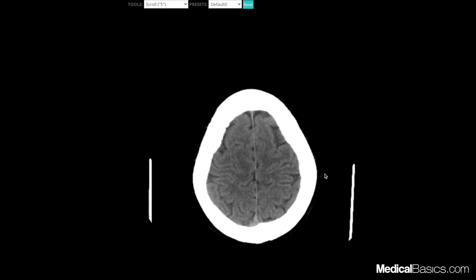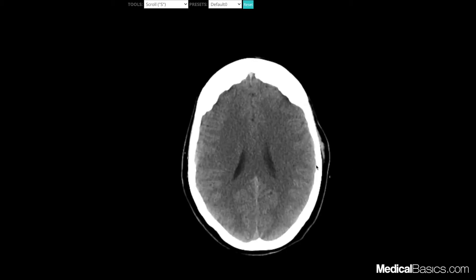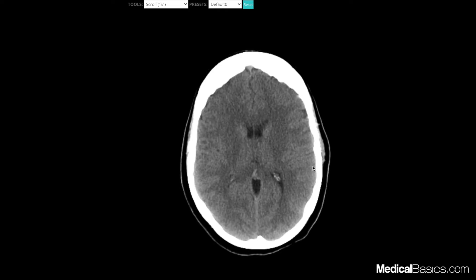When I first pull up a head CT, you're going to be wanting to look at the history, because depending on whether this is a stroke, a trauma, or whatever it may be, you're going to be looking at things a little bit differently. Let's say this is a general patient who comes in with a headache — so what may you be looking for? You're going to be wanting to look for a stroke, a bleed, any type of mass, or things like that.